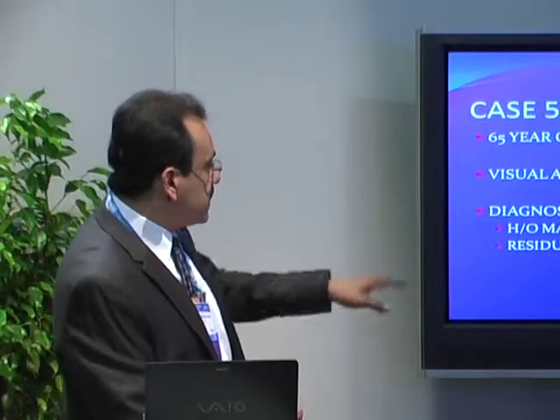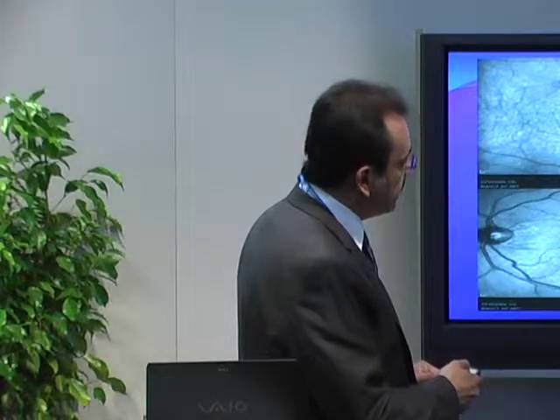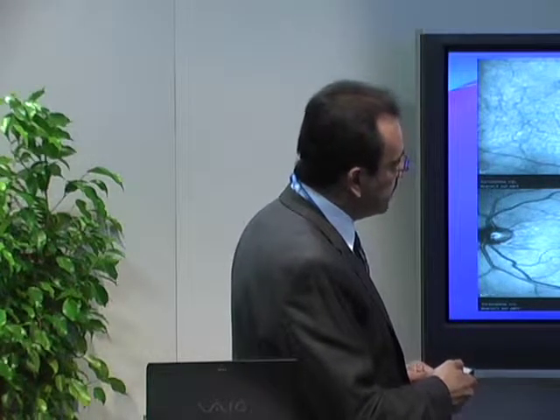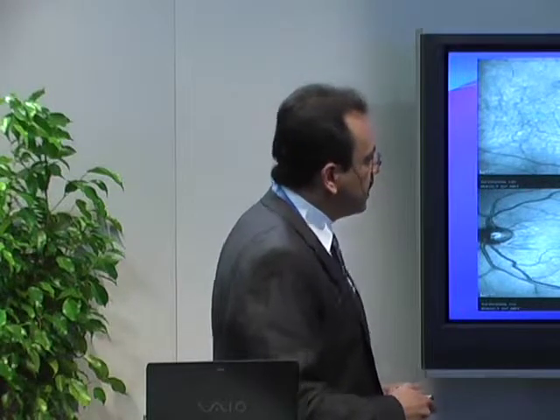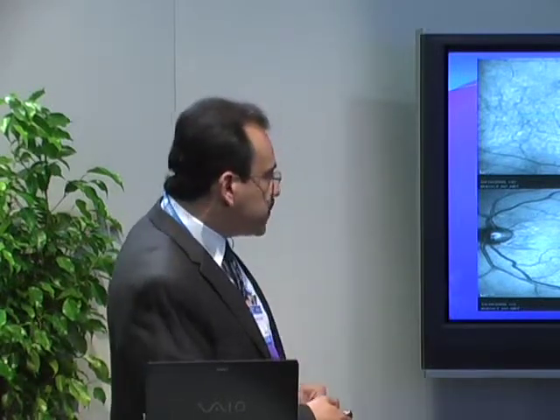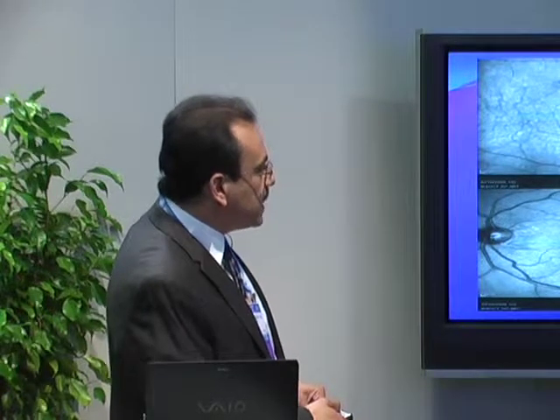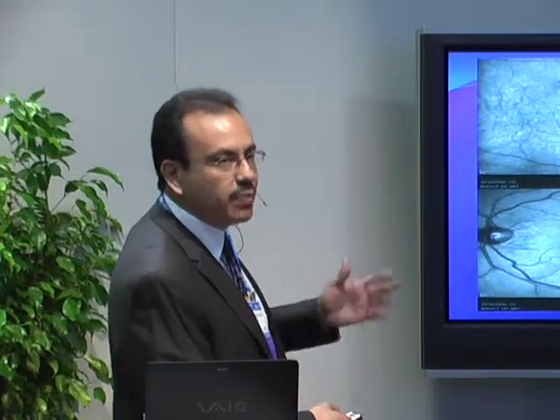So what do we find? Well, you can see the right eye everything looks great. The photoreceptor layer is intact. You get a nice anatomical central macular region. The left eye, you can see, has an intact photoreceptor layer across, but you can see that there's some anatomical changes on the surface of the retina. Okay, there appears to be some atrophy of the nerve fiber layer here. And unfortunately, pre-op, I didn't pick that up.